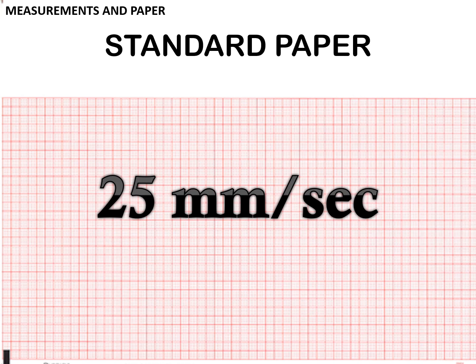It has to print. And the reason why this is true is because a lot of times those bedside monitors and those electronic screens, those things are compressed for time. So you'll see this whether you're looking at EKG or end-tidal CO2 or pulse ox or whatever. Whereas the paper that comes out of the monitor, comes out of the printer, comes out at a very specific rate of speed, and that rate of speed is 25 millimeters per second. Every single thing I'm about to tell you about what the little boxes and big boxes mean and what all the intervals mean and all these time intervals is based on the fact that the paper comes out of the printer at 25 millimeters per second.